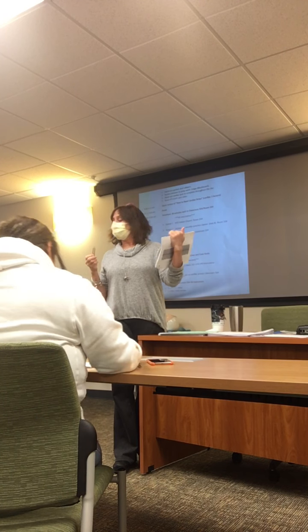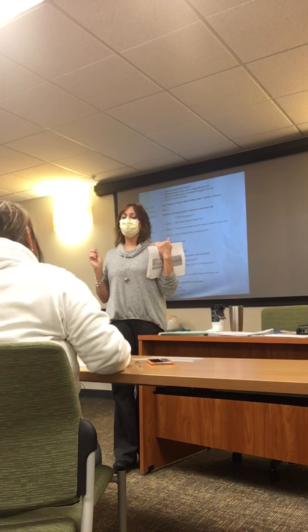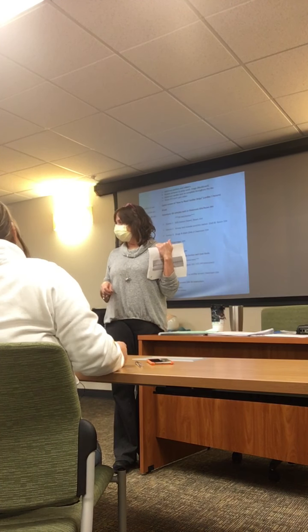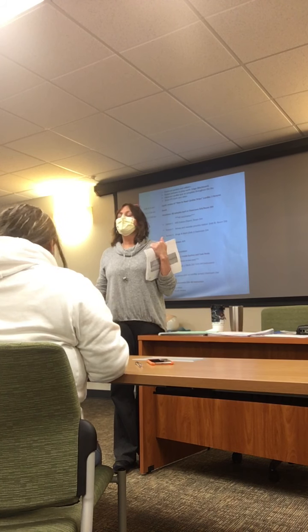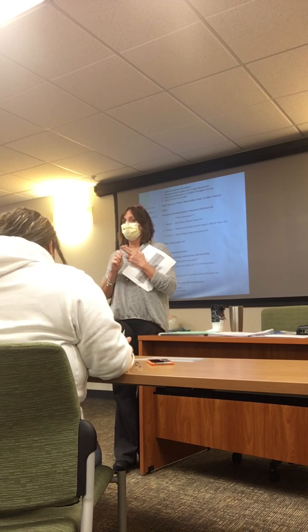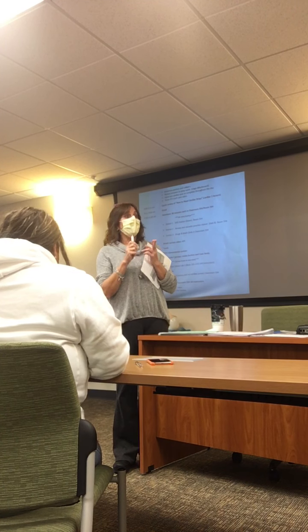0.08. Good. Is that normal? Yes. What's a normal QRS interval? Less than 0.1, 0.12, 0.12. Good. So for the exam, you need to know what the normal PR interval is, what the normal QRS interval is, and how to measure it.